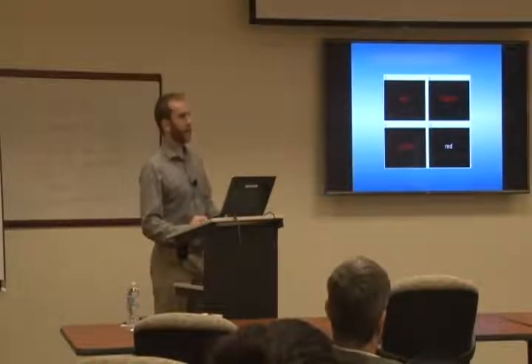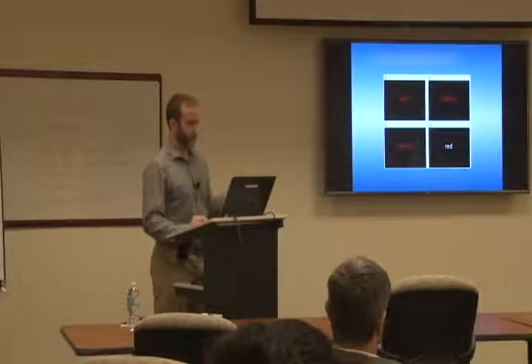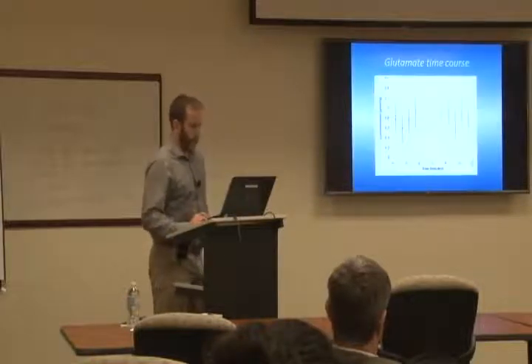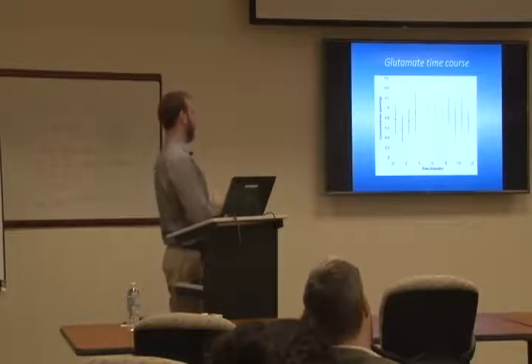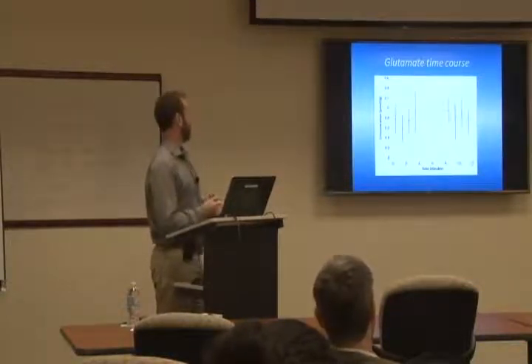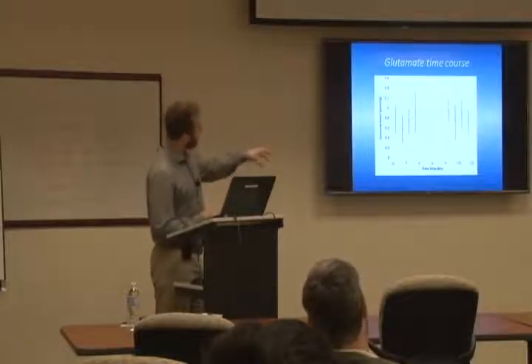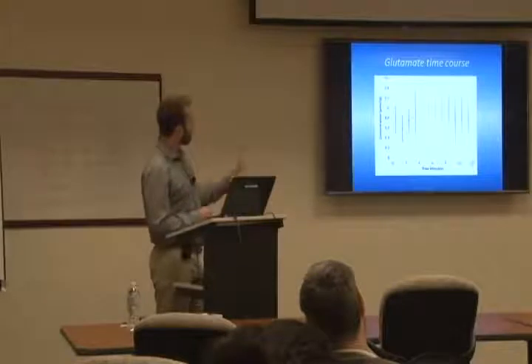We would give them 2 seconds to respond. And it did a very good job of activating the anterior cingulate, which was the point of this kind of proof of concept study. And our hypothesis was that we would see increased glutamate based on what other people have shown in the visual cortex and the motor cortex. And we did see that. It's kind of hard to see the block there, but it was a 4-minute region of activation. And yeah, we saw increased glutamate.